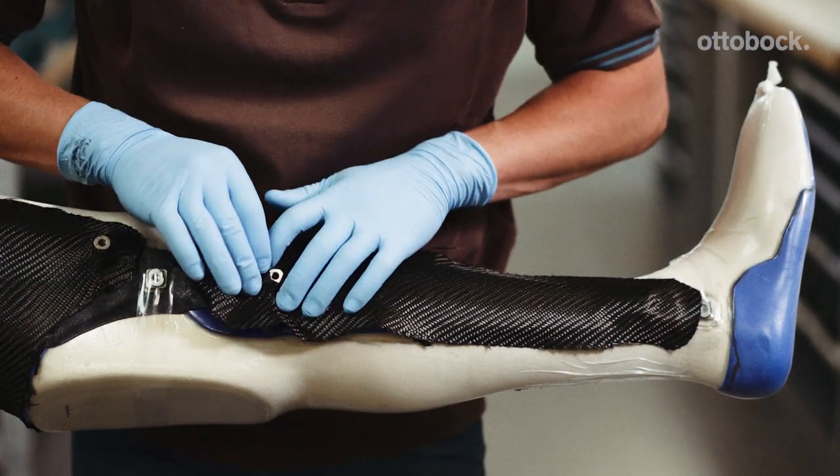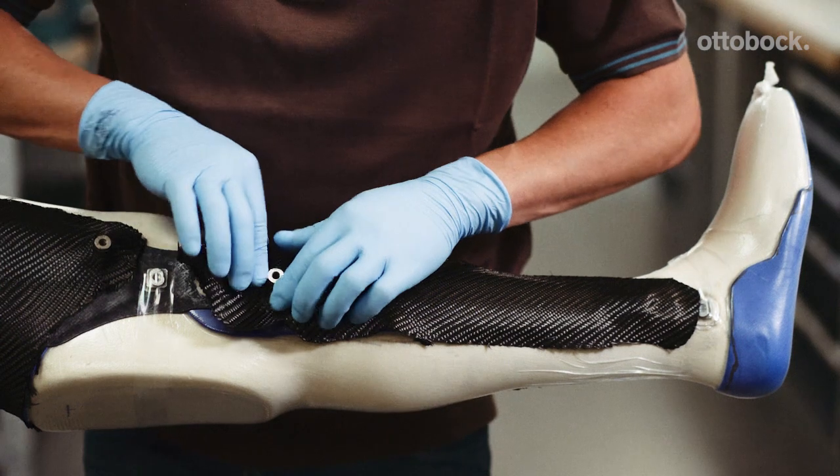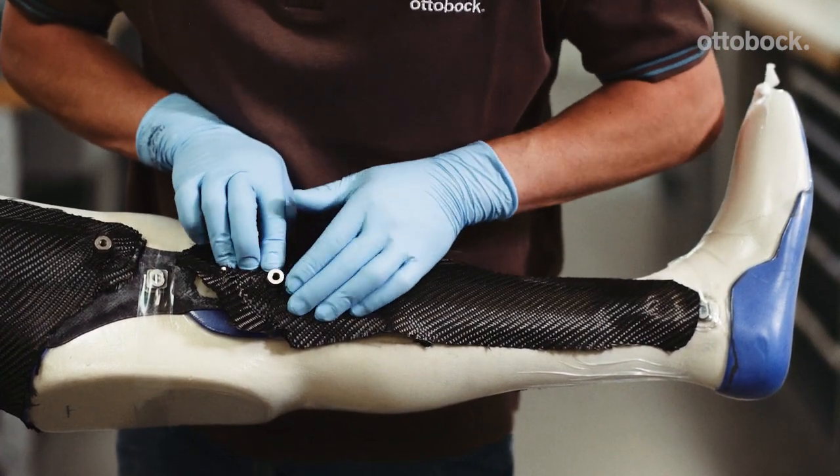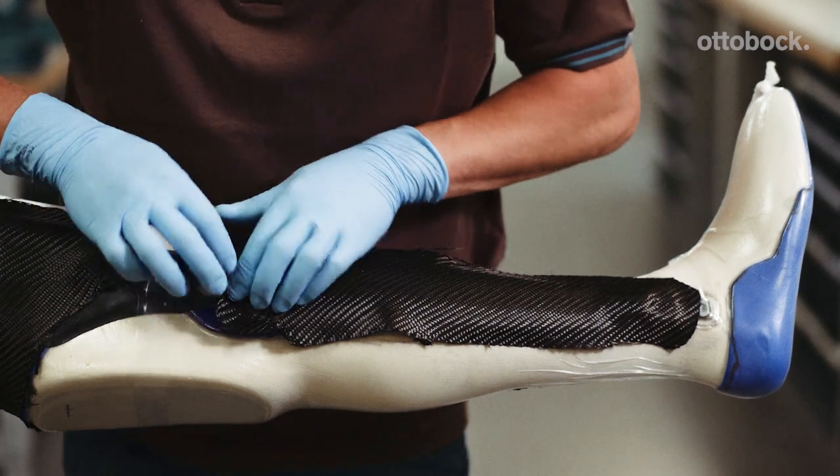Repeat this process with the lower leg layer with a 90 degree fiber direction. Make sure the anchor nuts are exposed again after each successive layer.